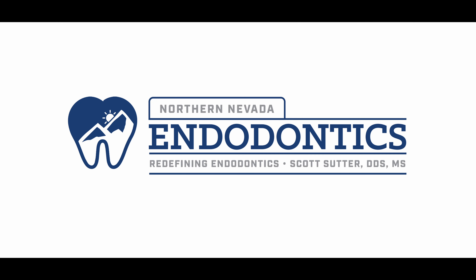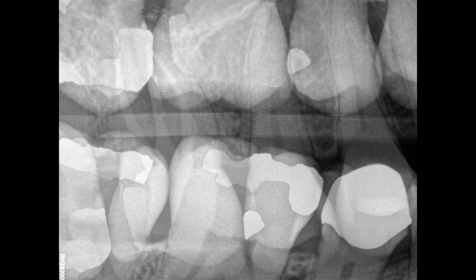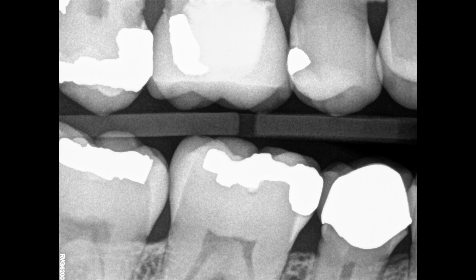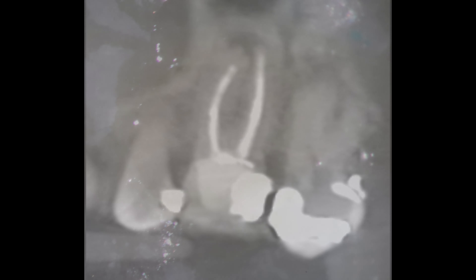Hello everyone, welcome back. We have a longer one for you today. Looking at these x-rays, you can see a short fill — looks like it was found in MB2. Nothing really on the bite wing to say anything of the occlusion. This patient was in pain. On the CT scan, there is an MB2 you can see, it does join, and you can see that apical finding. As the patient was having pain, we elected to go ahead and redo this one.